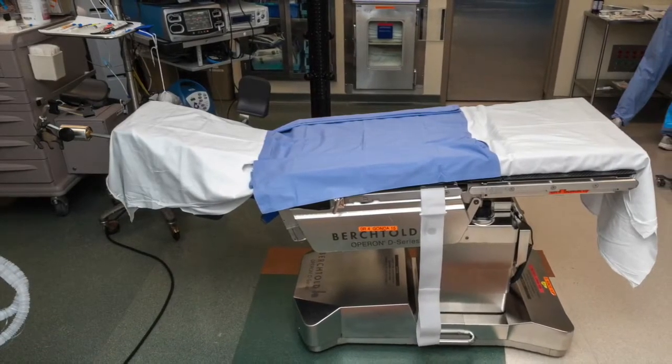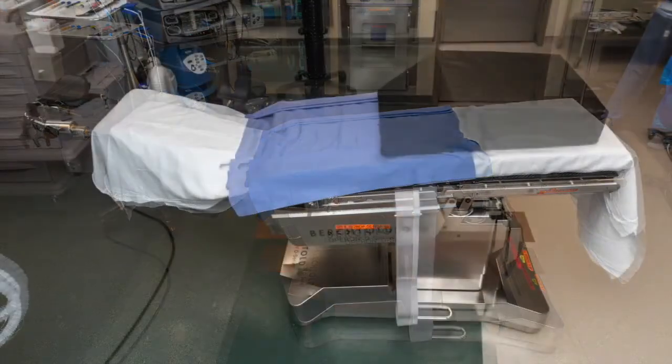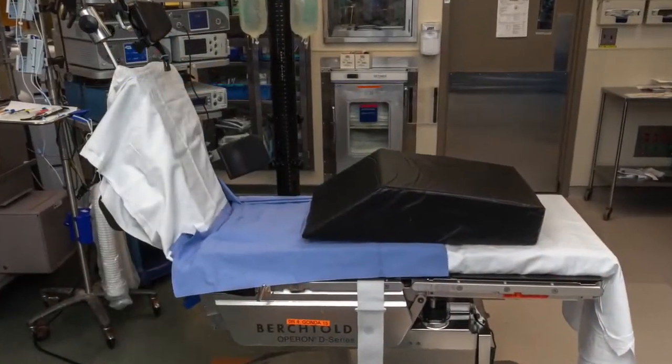This is done easily without moving them up or down to the right location once asleep. A leg foam ramp or pillow should be placed below the patient's legs to prevent the patient from slumping as they are sat upright. The bed will eventually be upright as shown here once the patient is positioned and anesthetized.